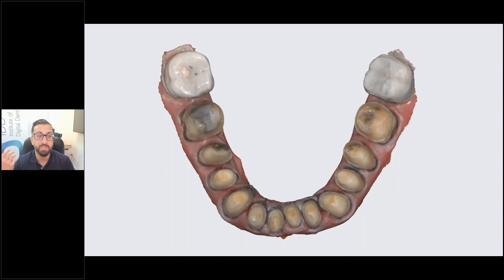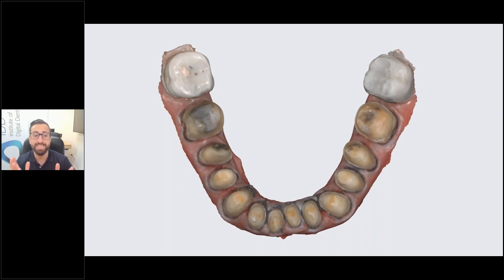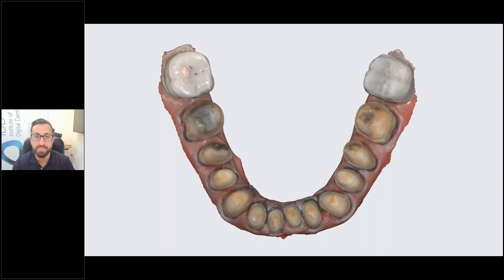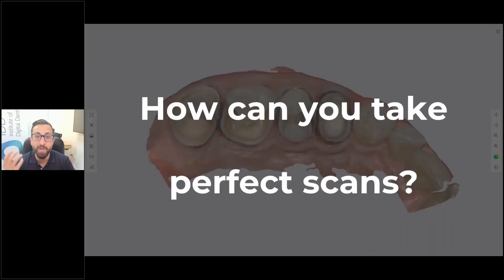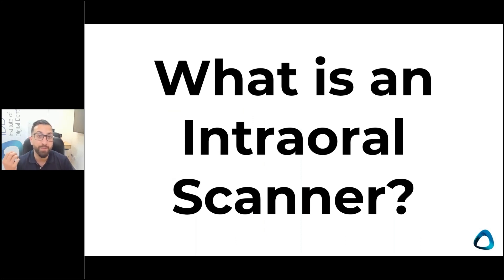This is another example taken straight from the Medit software — a case I completed just a few weeks ago of a full-mouth rehab, all scanned with the Medit i700, and all restorations were fitted. The key of today is to share as many clinical tips as possible of what I do day to day in my practice — how do you get these scans? That's really the key. How do you take the perfect scan? What is an intraoral scan is probably the first question we need to ask.